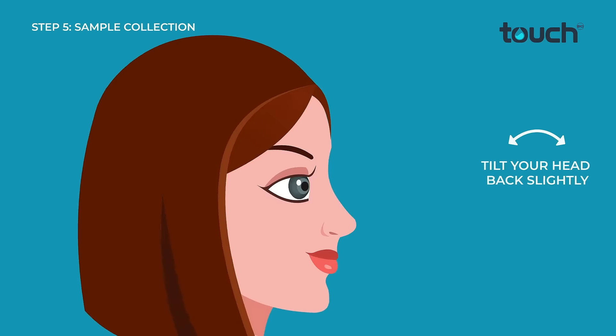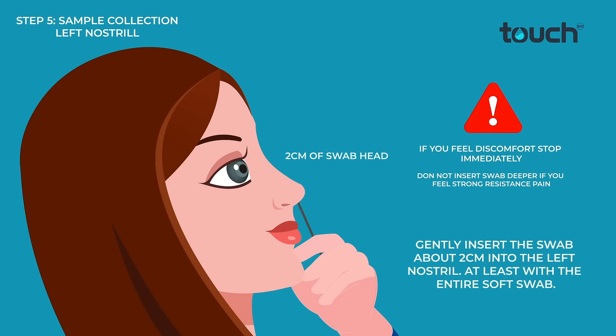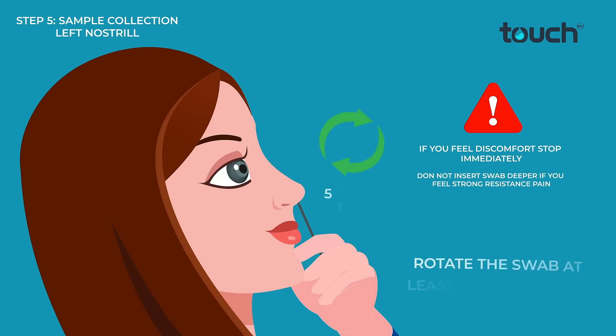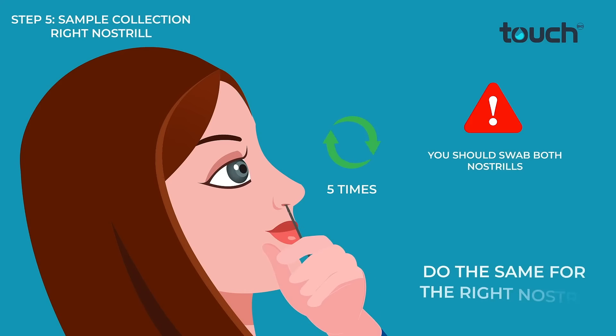Tilt your head back slightly. Gently insert the swab about 2cm into the left nostril, at least with the entire soft swab. Rotate the swab at least 5 times against the nasal wall. Do the same for the right nostril.